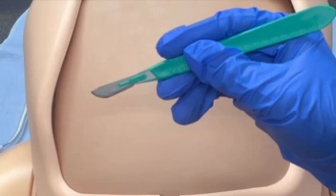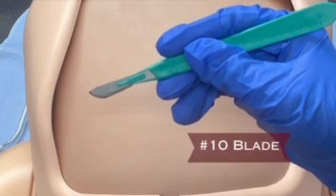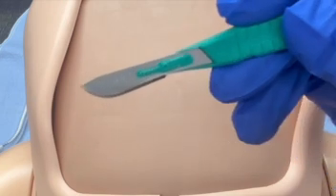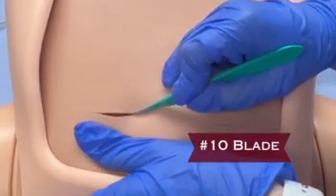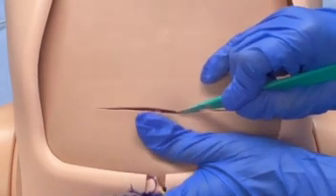The procedure begins with incision of skin and subcutaneous tissue. A number 10 blade scalpel is most commonly used due to its large, curved cutting edge, ideal for a large incision. When making the incision, it's important to use the belly of the blade and remain perpendicular to the surface to prevent beveling of the skin edge.